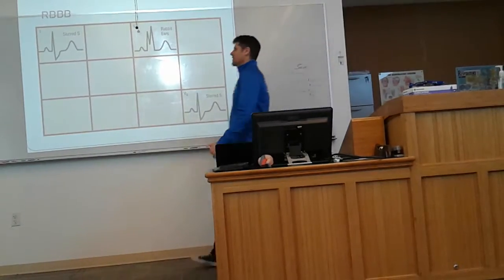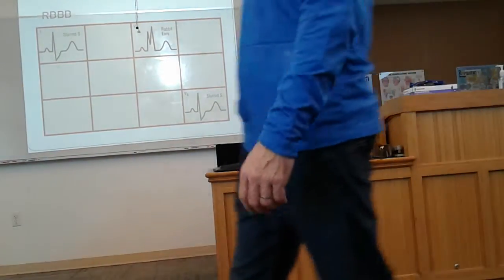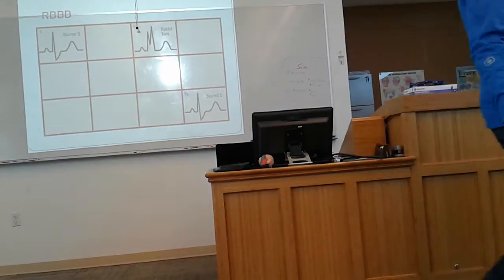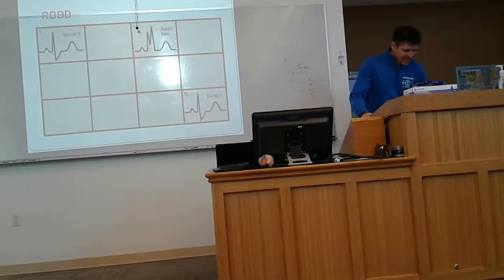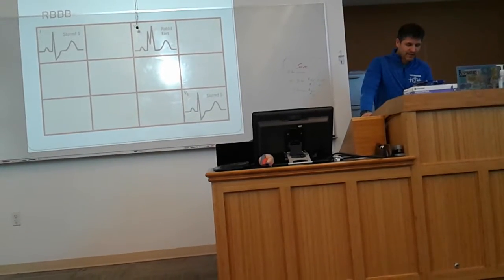Do we have a supraventricular rhythm in number 7? Yes. Is it a wide QRS? Yes. Which lead doesn't show you the wide QRS? None of them, because they're wide in all of them, aren't they? What about AVF? It's too biphasic to tell. But it doesn't show it. Look at AVF. That's a really small biphasic lead.